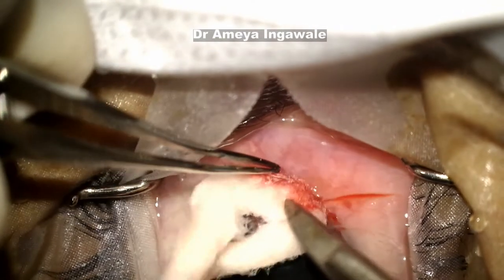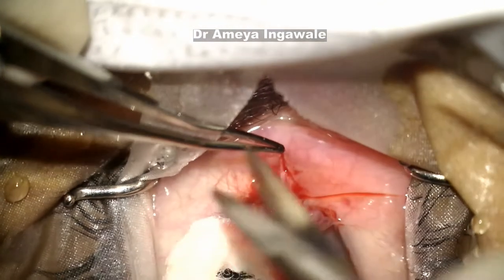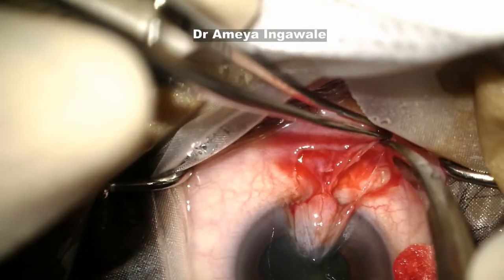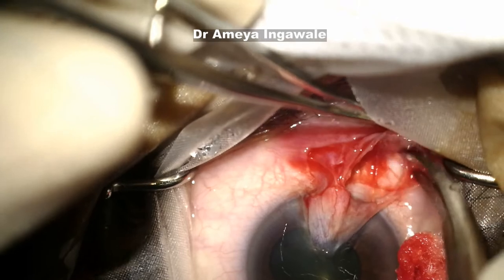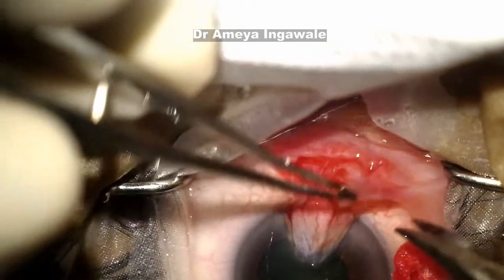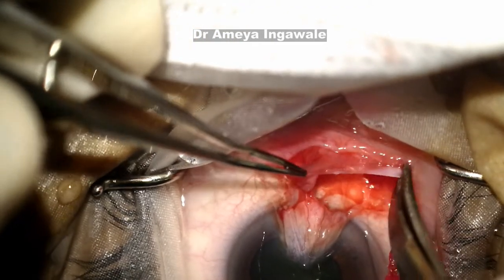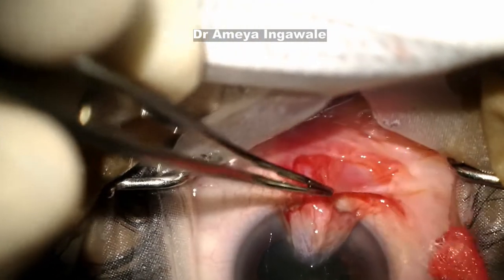Get the lateral margins correct. With a mixture of sharp and blunt dissection, make sure that you separate the proliferative conjunctival tissue from the conjunctiva over it. It is important to get the lateral margins perfectly, as the lateral part of the tissue is often the cause for recurrence. Make sure that your dissection extends all the way.